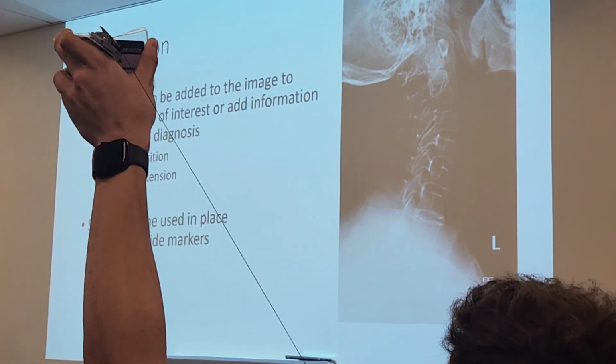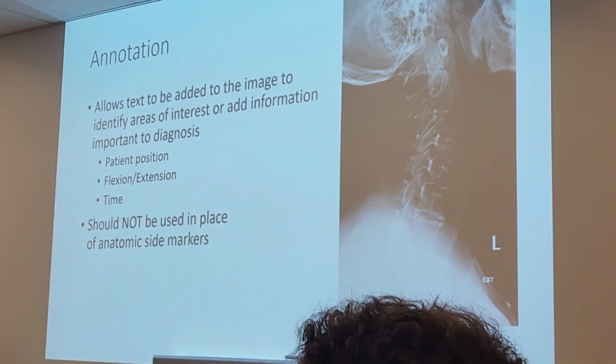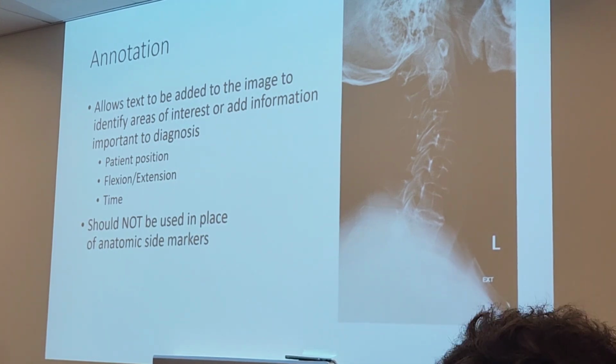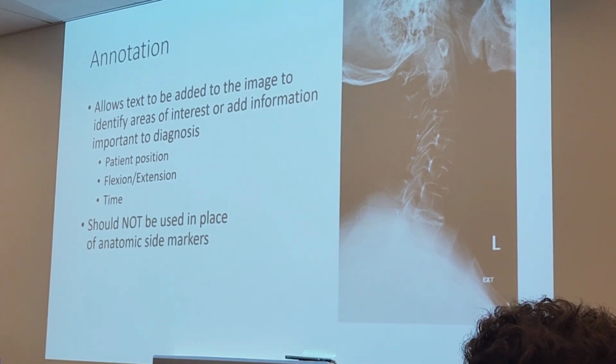Put your markers in the sky. All right, very good. So, digital annotation. You should not use this in place of physical markers. All images should have a physical marker.